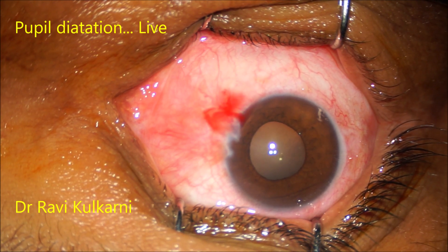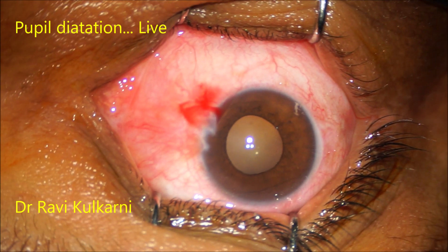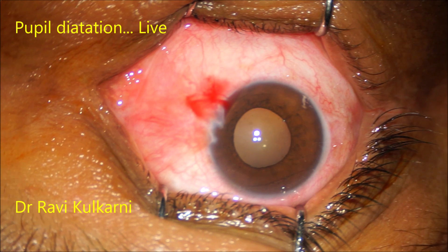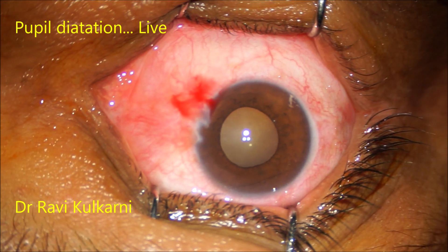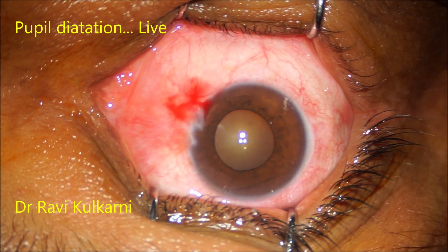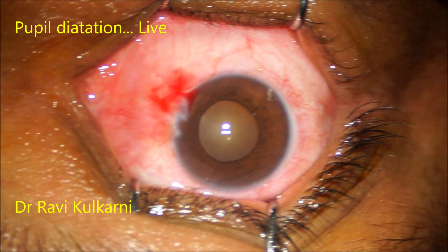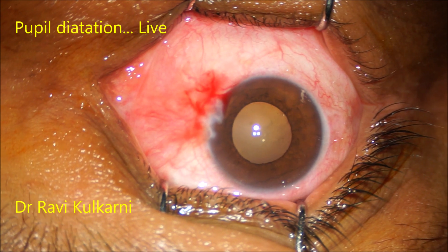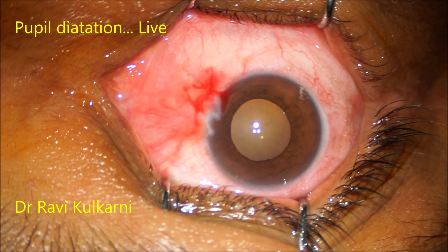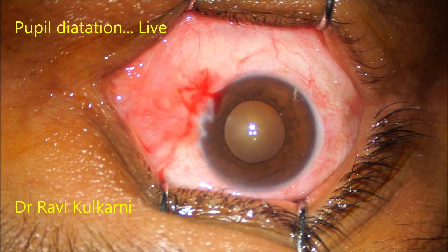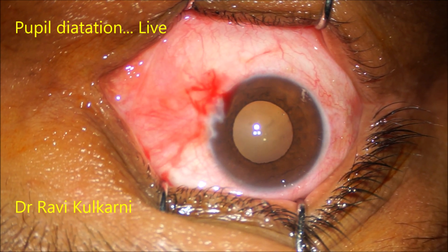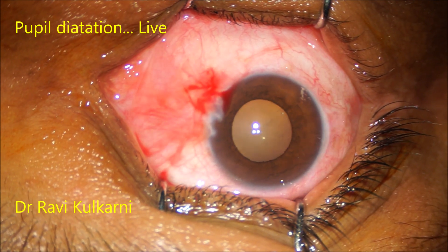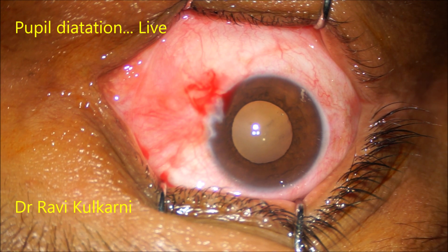When we are taking a cataract case entered into the OT at the last moment, we can give intracameral preservative-free adrenaline. The pupil dilates like this.